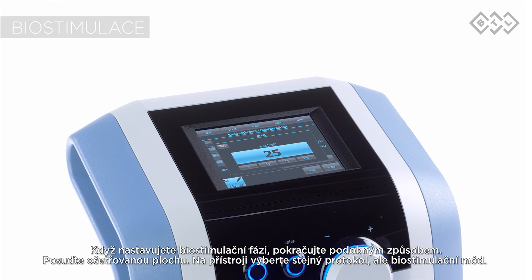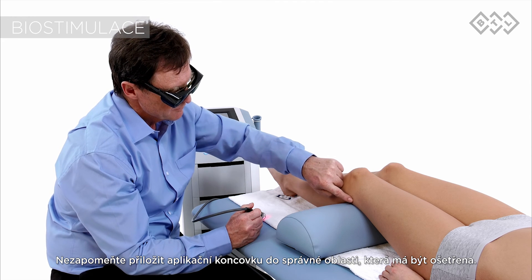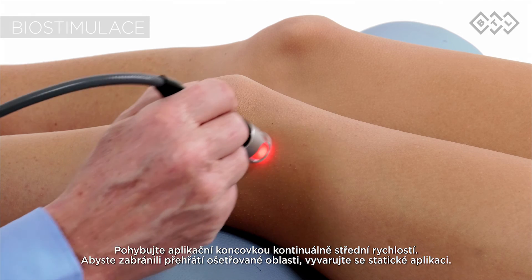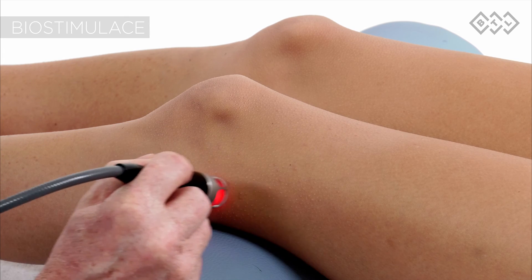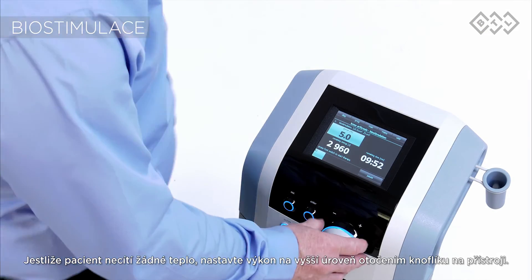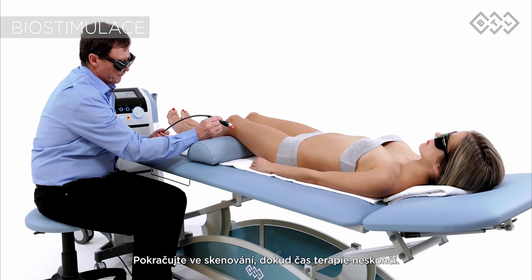Continue in a similar manner when setting the biostimulation phase. Assess the area to be treated, select the same protocol on the device — this time in biostimulation mode — and remember to enter the proper area to be treated. Biostimulation is delivered by scanning across the treated area, covering the whole area evenly. Move the applicator continuously at medium speed and prevent static application in order not to overheat the area. Biostimulation is a thermic therapy, so it is essential to get patient feedback on the levels of warmth they are feeling. If no heat is felt by the patient, adjust the power to a higher level by turning the knob on the main unit. Make sure the warmth is pleasant for the patient and continue with the scanning motion until the therapy time is up.